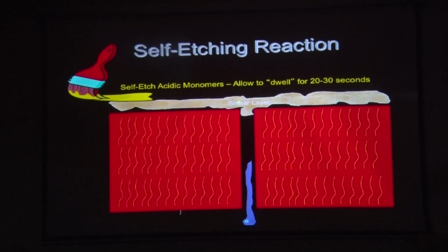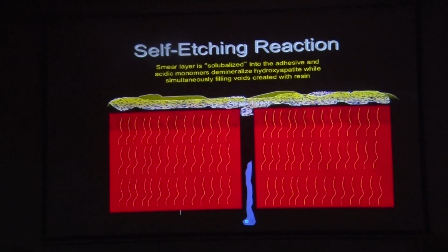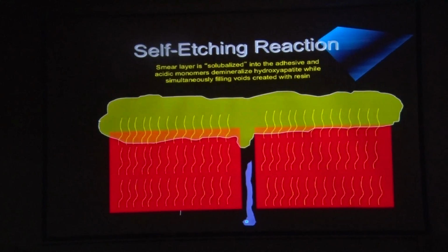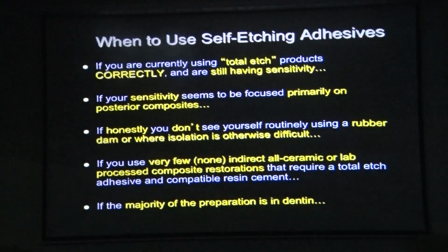So basically self-etch is bonding through the smear layer. It is eliminating some smear layer here, some smear layer here, it is modifying it, and it is keeping the biological band-aid intact. That's why patients don't go into post-operative sensitivity. So it bonds through a smear layer, you air blow vigorously, you light cure, you place your composite, you get good hybridization.